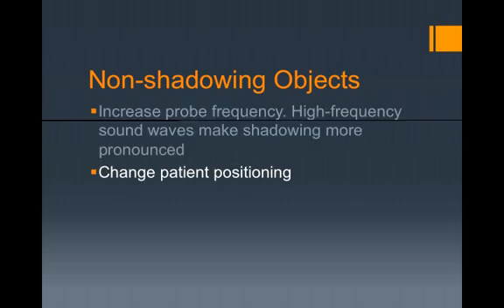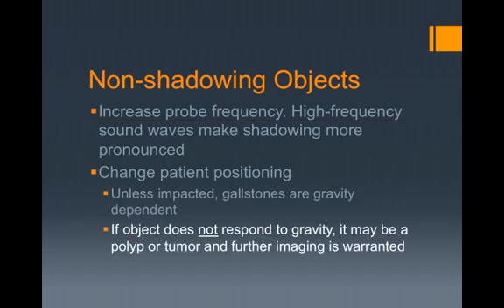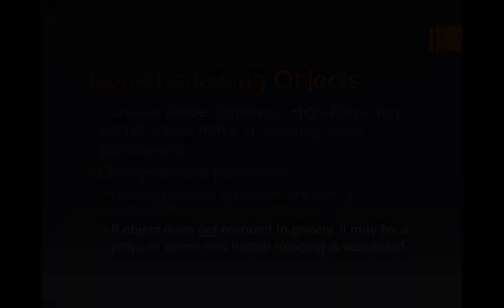You may also change patient positioning. Remember, however, that gallstones, unless they are impacted at the neck of the gallbladder, are gravity dependent. Therefore, if an object does not respond to gravity, it may be a polyp or a tumor. In these cases, further imaging by radiology is warranted.